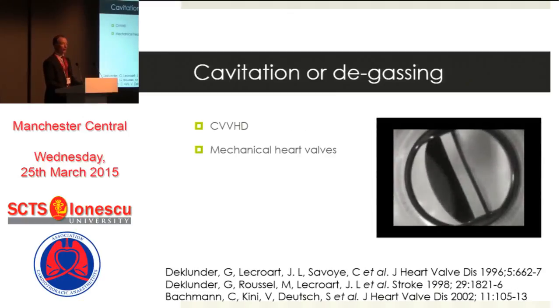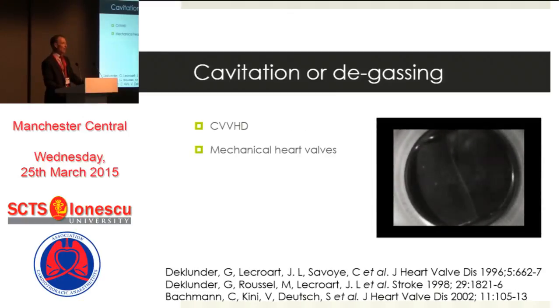This is also what occurs each time a mechanical heart valve closes, that at the point of maximal acceleration, gaseous cavitation causes the generation of bubbles, and the subsequent vortex generates further microbubbles, and these can be detected by transcranial Doppler with a frequency of 0.2 up to 5 hits per minute, every minute that a patient has a mechanical heart valve opening and closing in their heart.